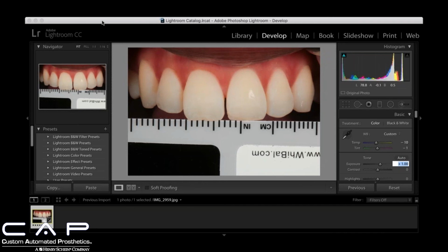So if I worked hard at it, I could probably find maybe a slightly better exposure. But first of all, what you want to do is click on the exposure meter, so it turns blue there, and then you scroll back over to where you selected on the white balance card, and you leave it, and you just use your arrow keys, and you adjust up or down that exposure until your histogram is as close as possible to L79, A0, and B0.